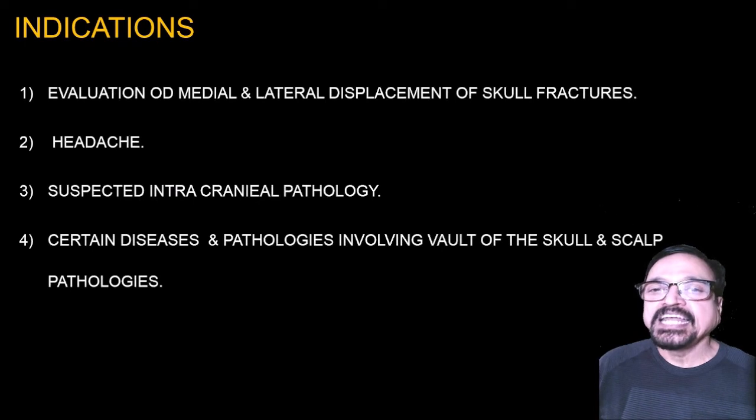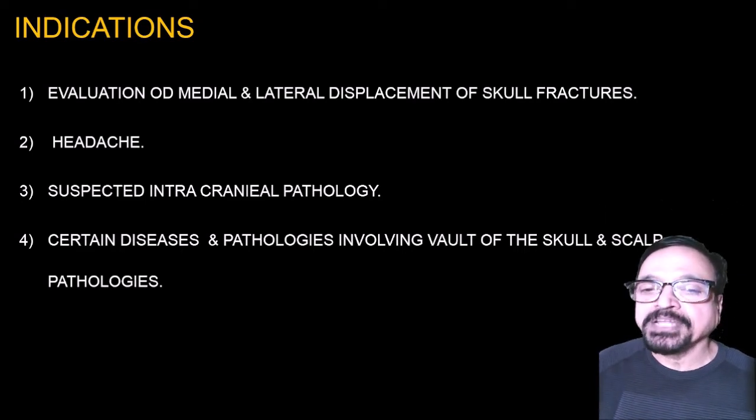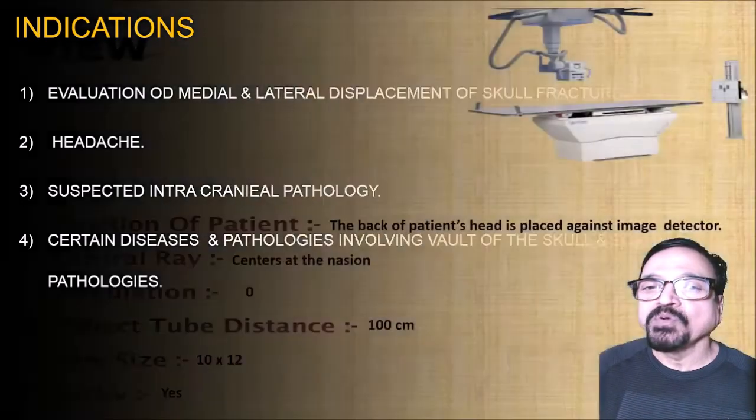What is the indication? Evaluation of medial and lateral displacement of skull fractures, headache, suspected intracranial pathologies, and certain diseases and pathologies involving the vault of the skull. So in that condition we will have to go for these.